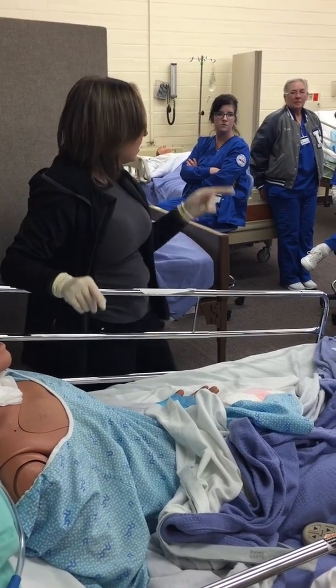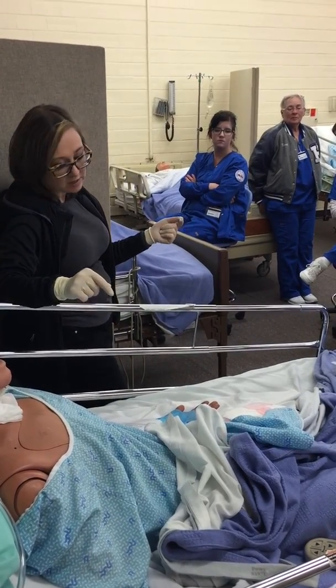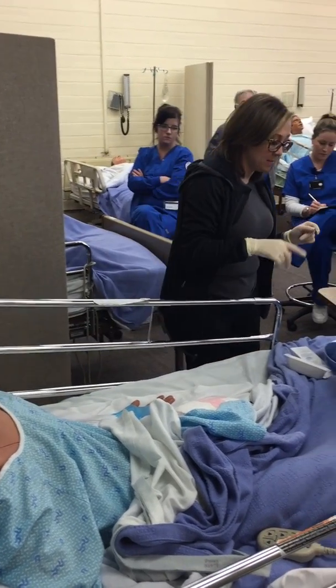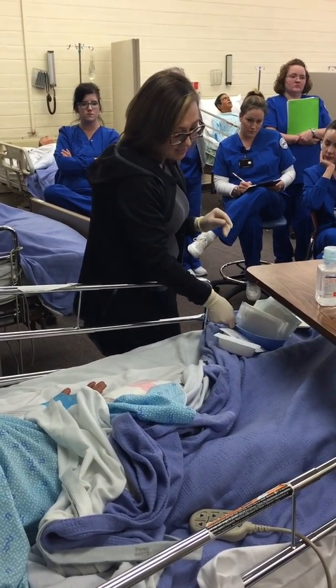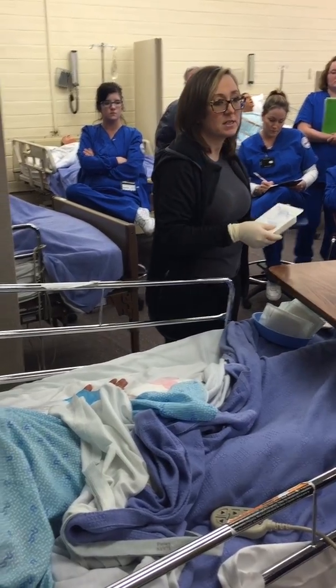I have all my stuff ready. You guys need to have a trash can right here because you're going to be putting stuff into the trash can. Okay, so you're going to want to have a trash can. I'm going to set all my sterile stuff up, and you don't have to have gloves. Like I said, pretend I don't have gloves on right now. I'm going to set my sterile stuff up, and I'm only going to use one of these for this guy, so he doesn't have a bad one.